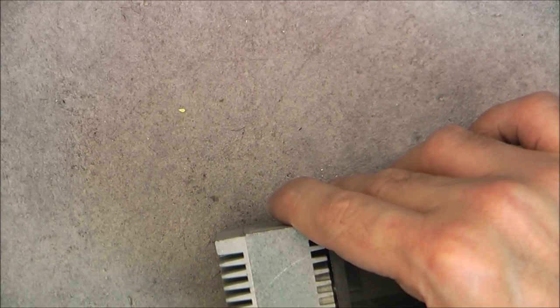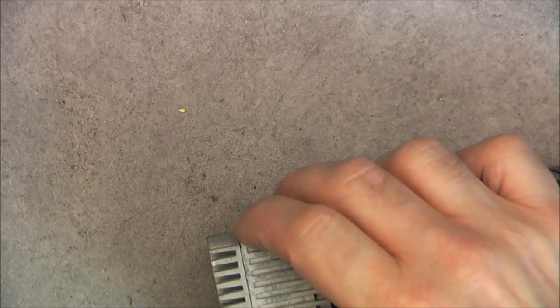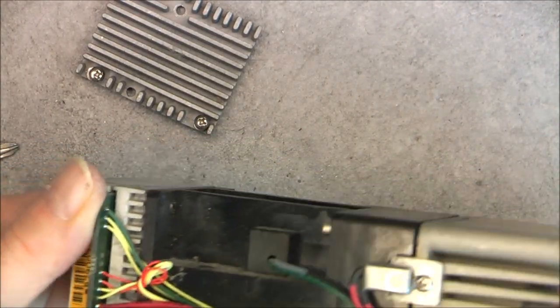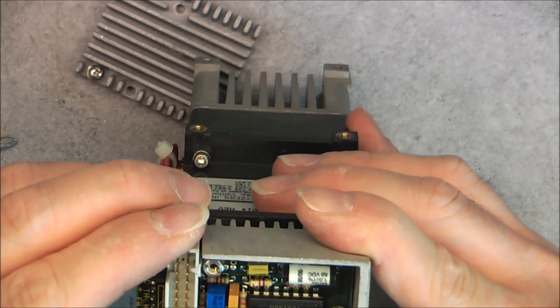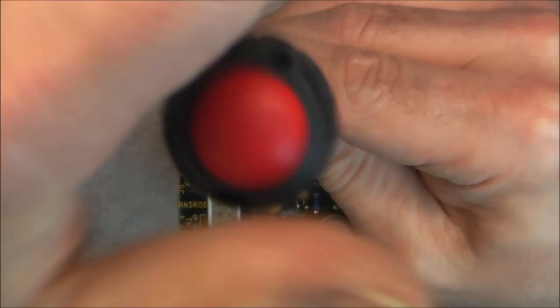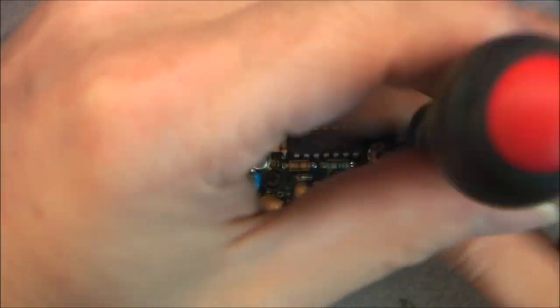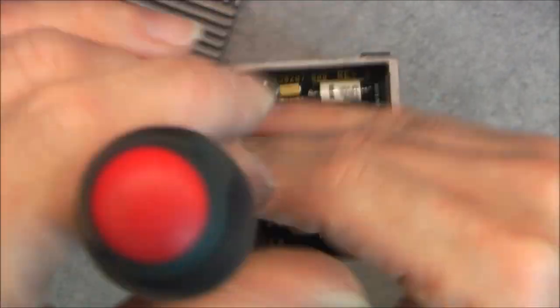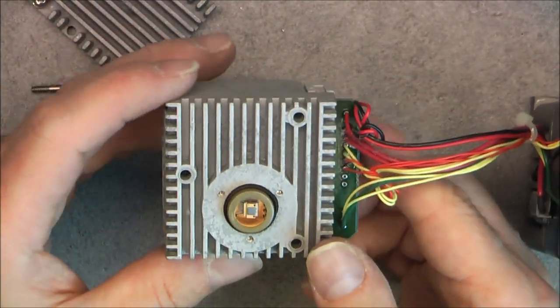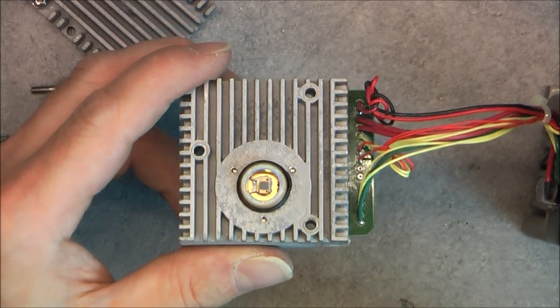So now the apparently sensor side has just three Phillips screws. Quite serious heat sinking, by the way, in this compartment. And here. Okay, we have front end for something that requires more disassembly, as always. Three standoffs. Is it all? It allows to undo this part and show this sensor assembly.